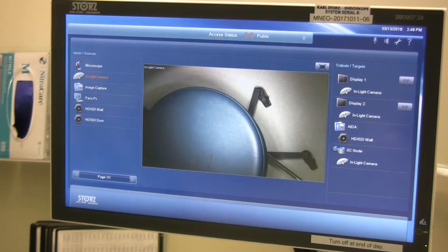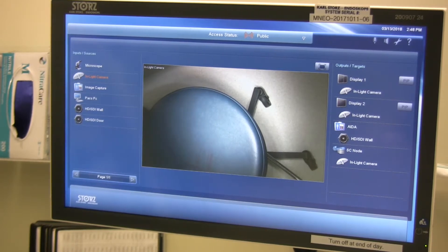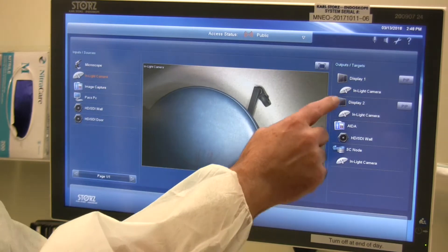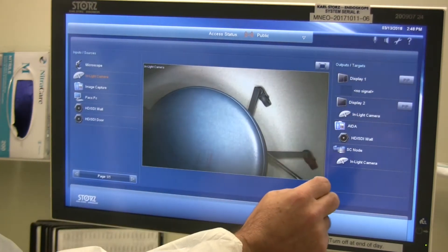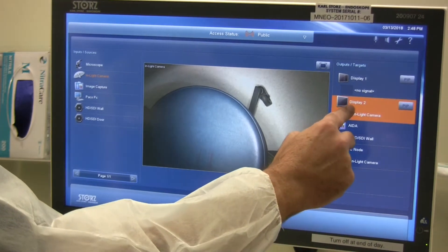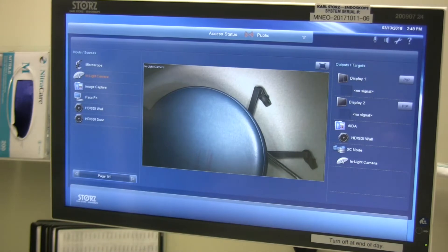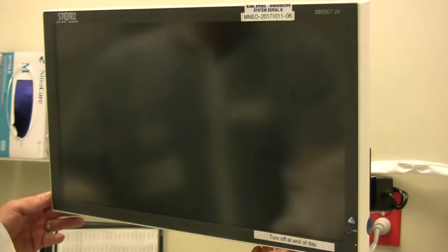At the end of the day, it's very important to power down both the displays and the touch panel in order to maximize operational life expectancy. It's a two-step process. First, power down the displays by pressing and holding the display tab for two seconds — it's asleep. Then at the bottom right-hand corner, press the blue button to put the touch panel to sleep as well. Now the entire system is in rest mode.